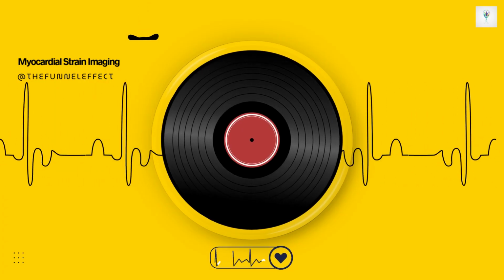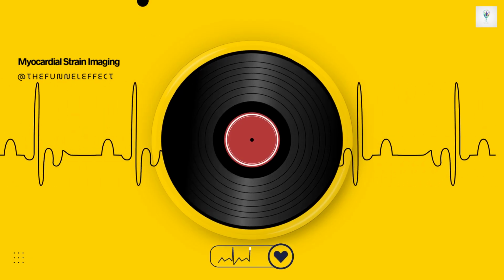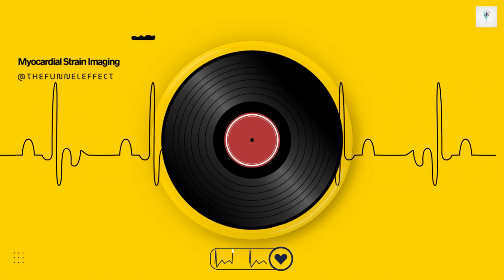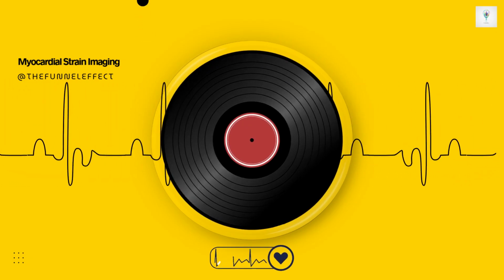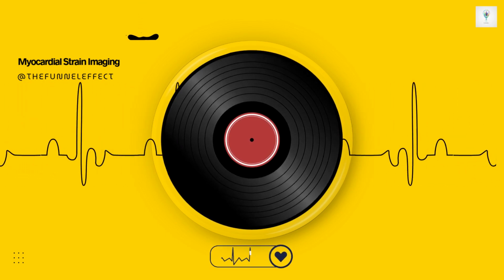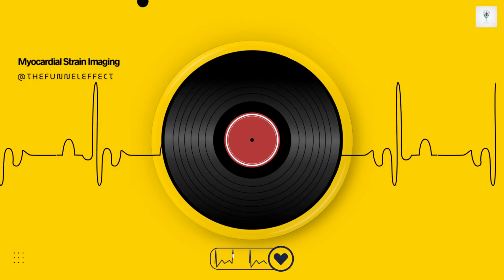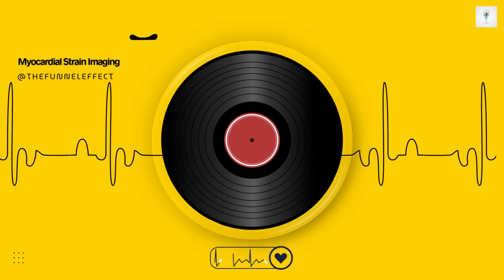Now, measuring true torsion requires knowing the exact distance between the apical and basal planes, which sounds technically difficult. How do clinicians handle this practically? You're right. Accurately measuring the longitudinal distance to calculate true torsion can be tricky and variable. Because of those technical limitations, the review suggests a simplification for clinical use. Which is? Since the rotation of the apex makes the largest contribution to the overall LV twist value, just measuring apical rotation by itself is often used as a simplified, practical, bedside index of LV twist or torsion in many clinical settings. It's not perfect, but it's more feasible.